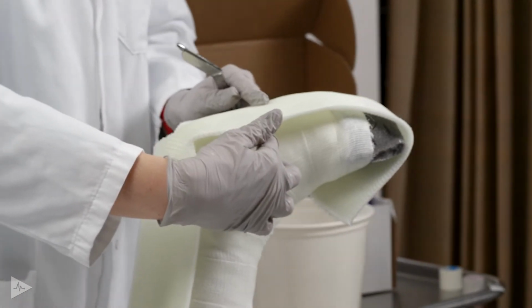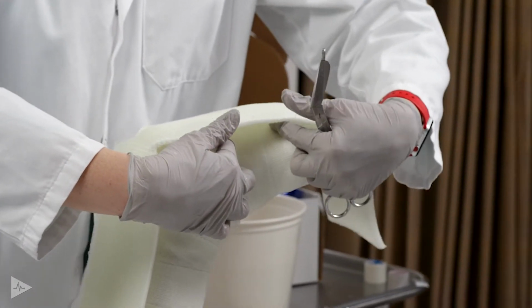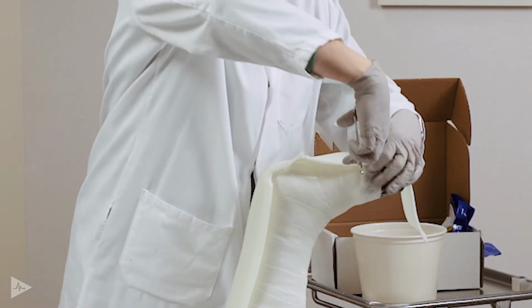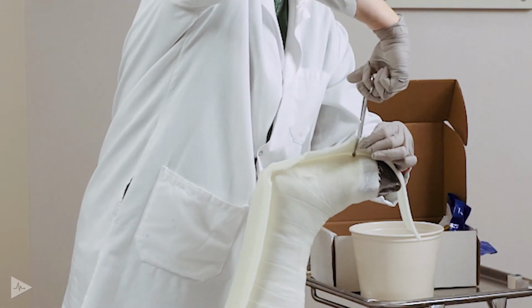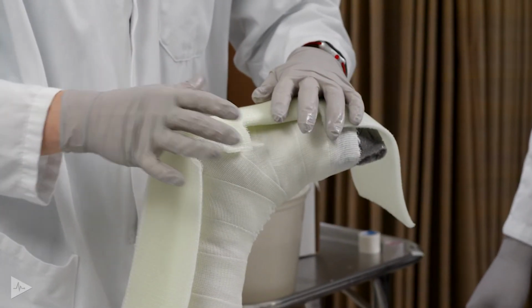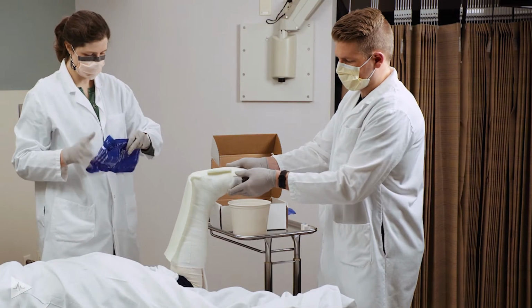And so you can feel back from the heel where that starts and then from the front where that ends. And we will make little cuts in on both sides. And you're going to about the midfoot with these cuts. And then this piece will be turned underneath to fill in that arch and provide support for the peg that will come next.